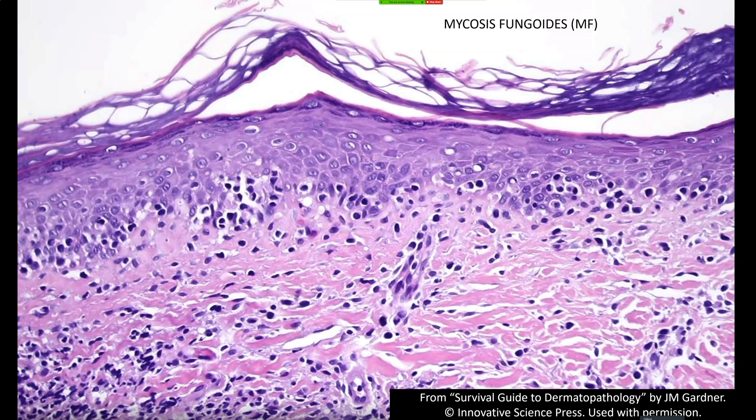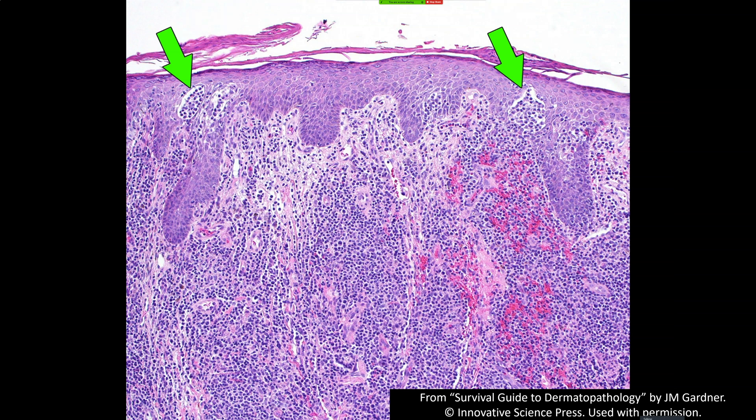The wiry collagen and the lymphocyte tagging are all useful features. Here, the tagging is highlighted by CD3, which is a marker of T-cells. Essentially all normal T-cells are CD3 positive, and most T-cell lymphomas will be CD3 positive as well. You can see they're completely replacing that basal layer with lymphocytes.